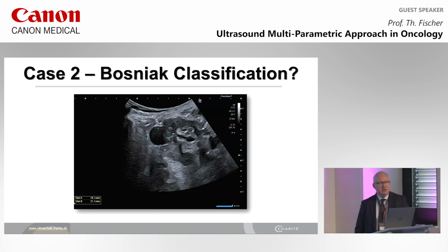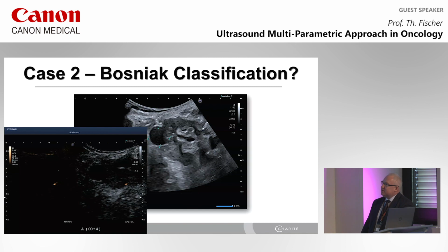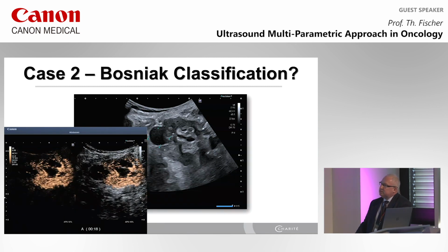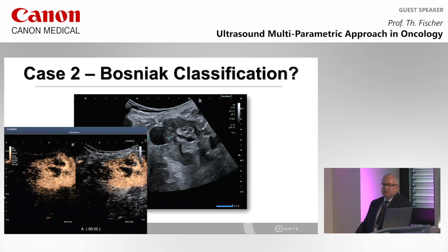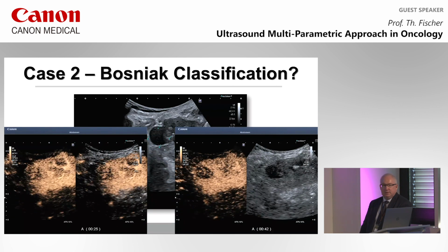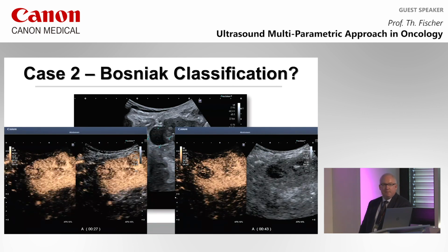Of course. Very good. You are in the right session. Perfect. Thank you so much. So I give you the contrast application. Simple cyst. No, you see the overlay. Contrast inside. Unbelievable. And look at this. What is your diagnosis?